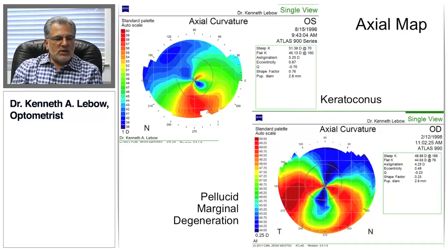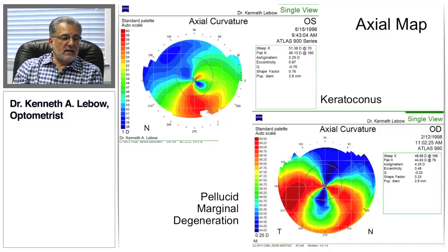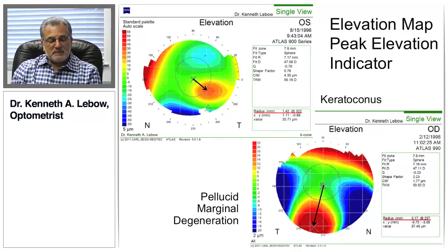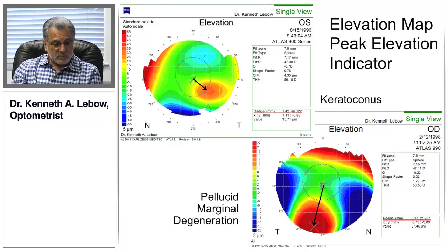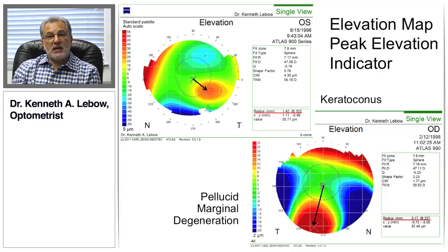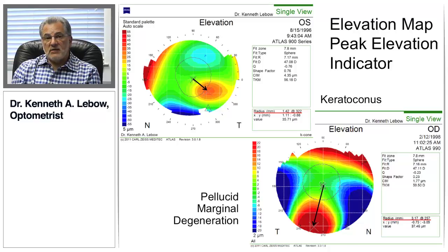This composite image shows an axial map for keratoconus top left and an axial map for pellucid's marginal degeneration bottom right. This next image is of elevation maps, and what I've done is create what's called a peak elevation indicator — measuring the distance from the center of the eye to the highest point on the elevation map. Because of the differences in where the thinning takes place, the peak elevation indicator will actually be further from the apex of the cornea in pellucid's cases than in keratoconus patients.